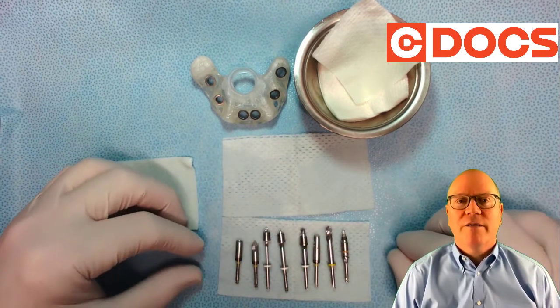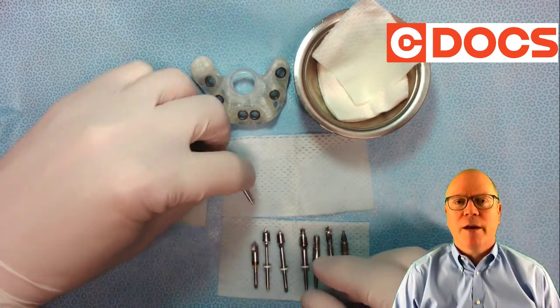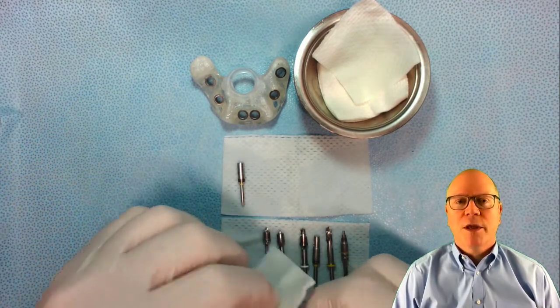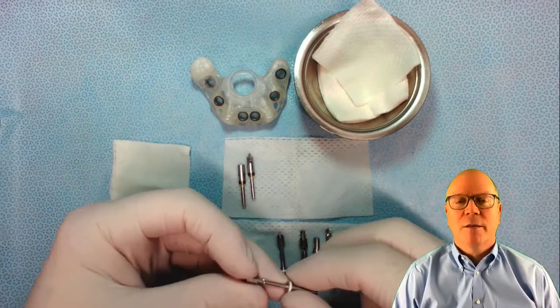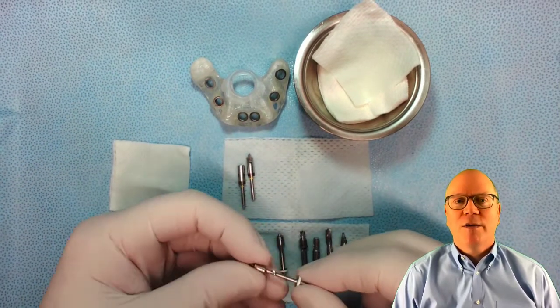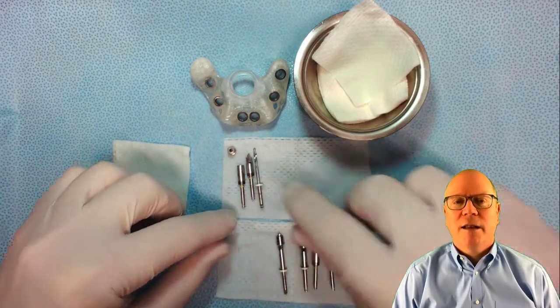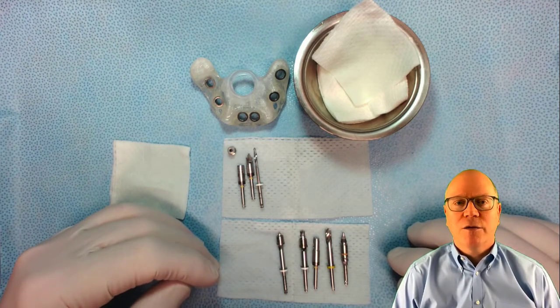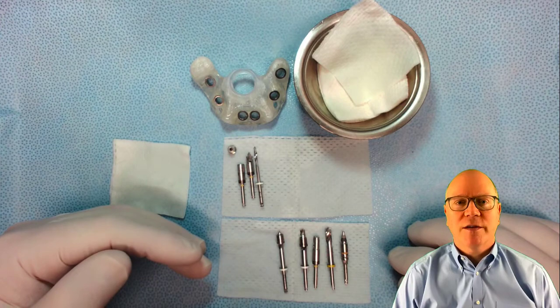Now once everything's all set and I'm using them, I take a damp two-by-two and wipe that off. You can use saline, peri-guard, or peroxide, whatever. Same with the initial drill — wipe that off. The cleaner it is going into the sterilization process, the better off it's going to be. Now when I'm doing the one, three, and four, I take the sleeve off and then line that up, so I know what I've used and what I've not used, all in the correct sequence — and that's how I organize my surgical tray.